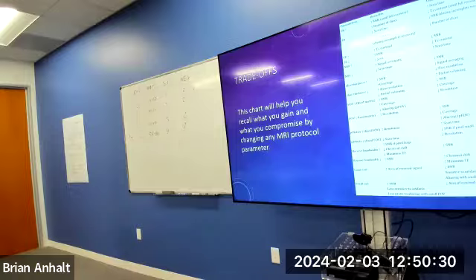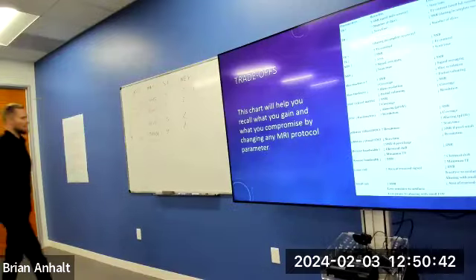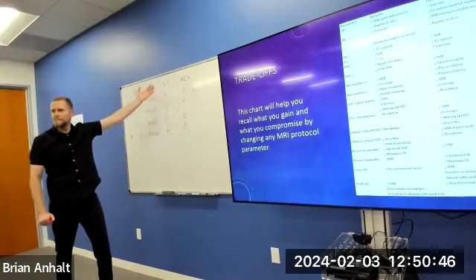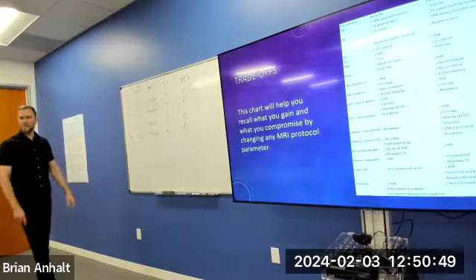Look at field of view. Go straight to your slice thickness. Look at your matrix. We want coarse matrix, thick slice, large field of view. And then if there's 2 that are exactly the same, then your NEX is going to determine it, right? The highest NEX will determine that.